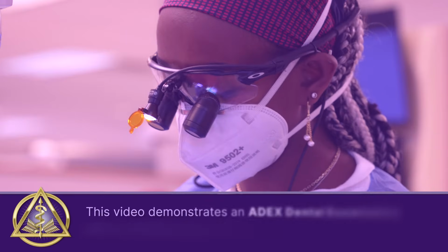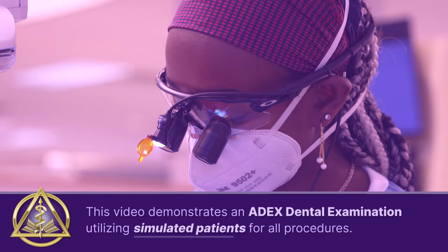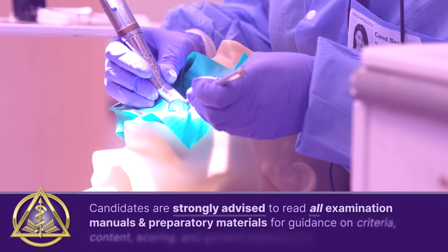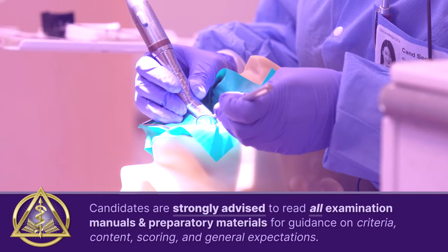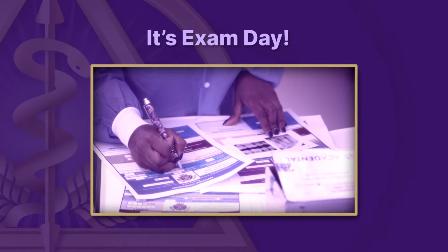This video demonstrates an ADEX dental examination utilizing the competent and simulated patients for all procedures. We strongly advise candidates to read all examination manuals and preparatory materials for guidance on criteria, content, scoring, and general expectations. Good morning. It's exam day.